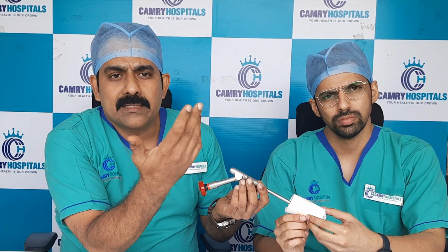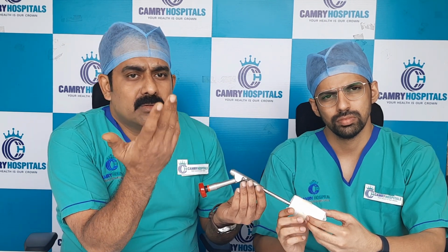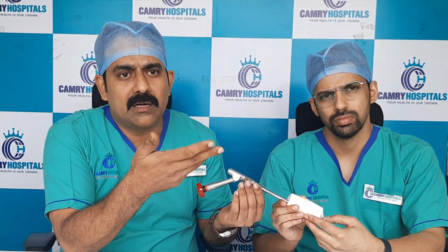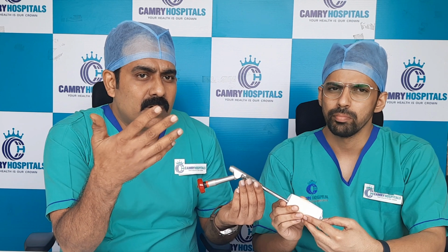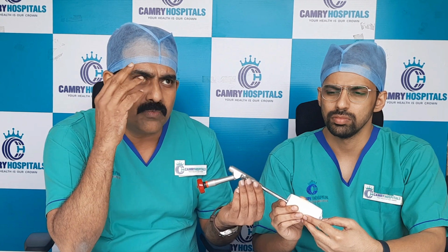And it takes around 20 to 40 minutes for a simple disc and around 1 hour for a single level surgery. The patient is awake while we are doing this. While operating, the patient tells us where the pain comes, any current sensation in the leg. So the patient gives us feedback, and we know which tissues to remove.